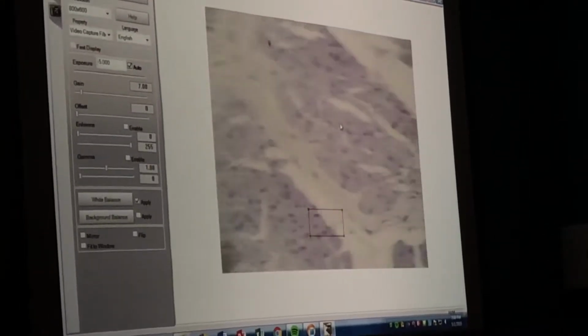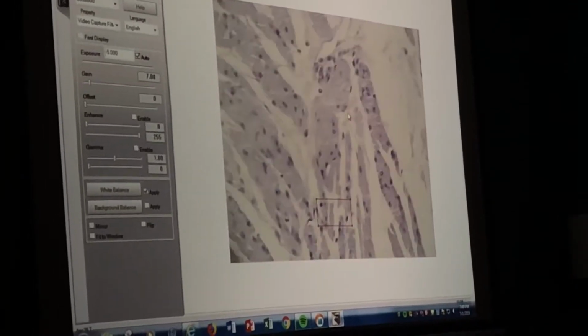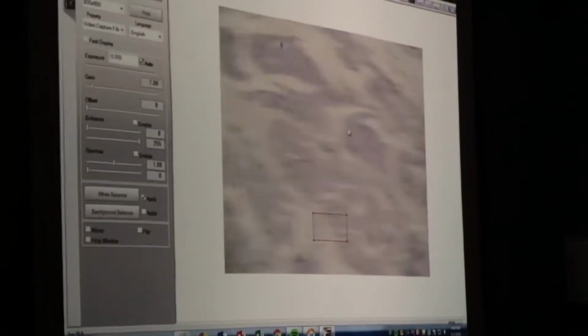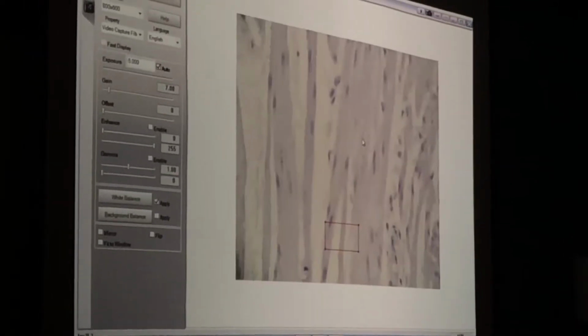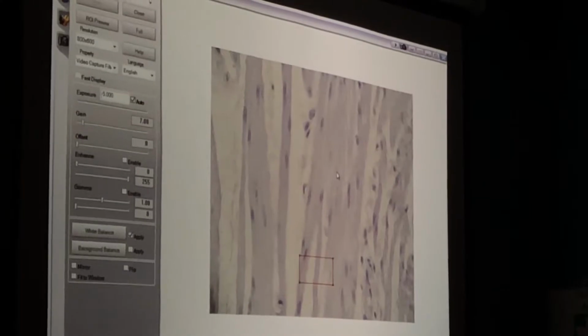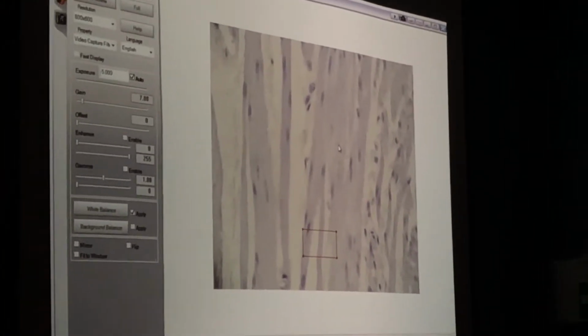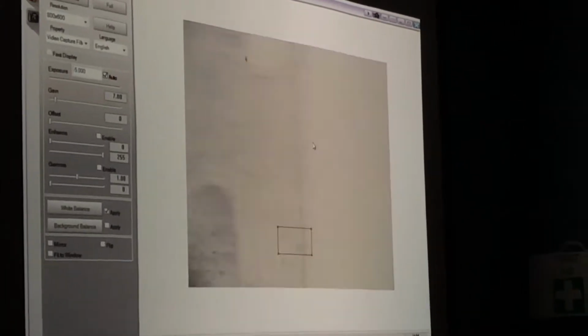Then what are we going to see next to that? Muscles. Yeah, so all of this stuff that we're seeing here is going to be the detrusor muscle. This stuff is going in all kinds of directions. So remember, the detrusor is kind of randomly oriented muscle fibers going in all directions, because when these contract, they're going to make that whole bladder collapse all at once.